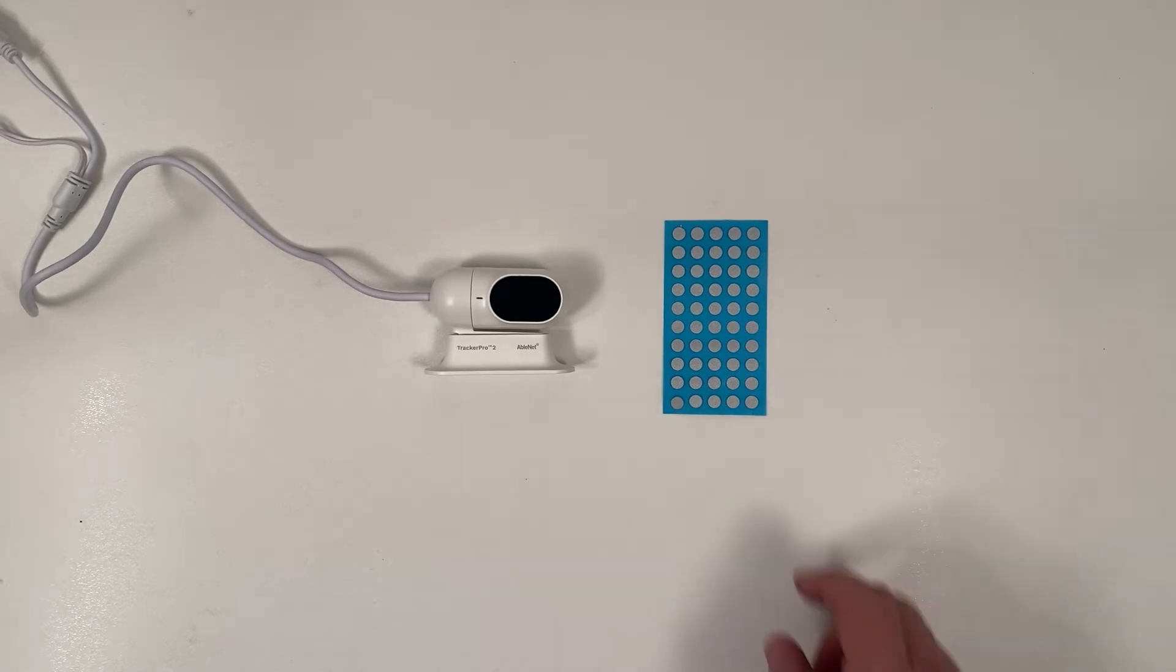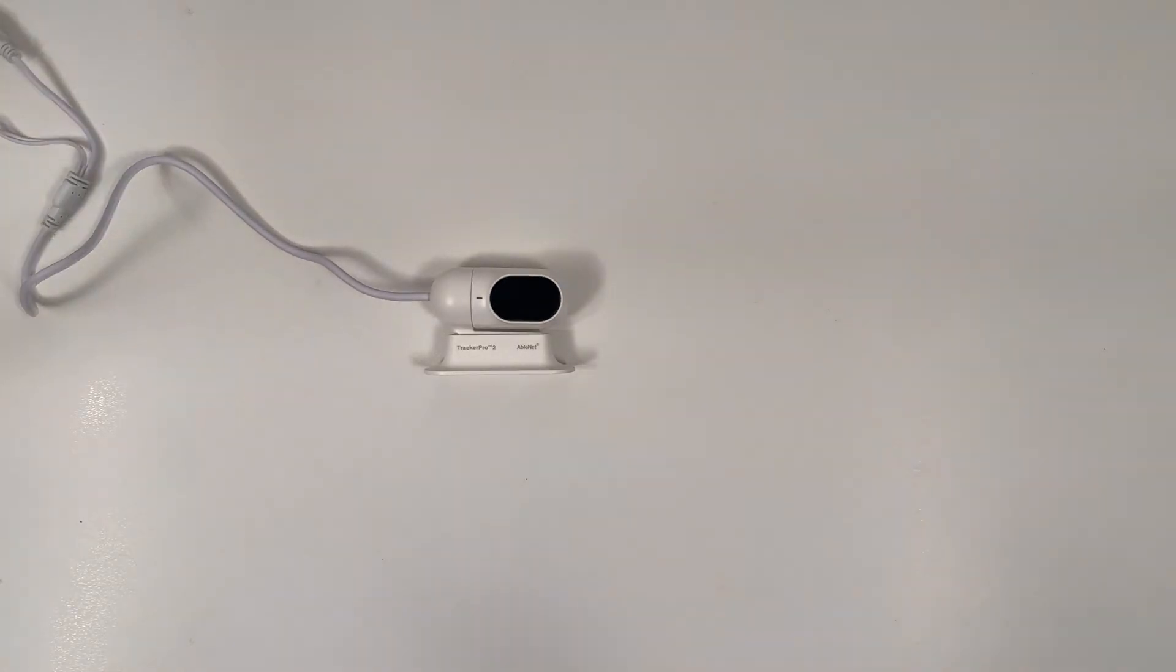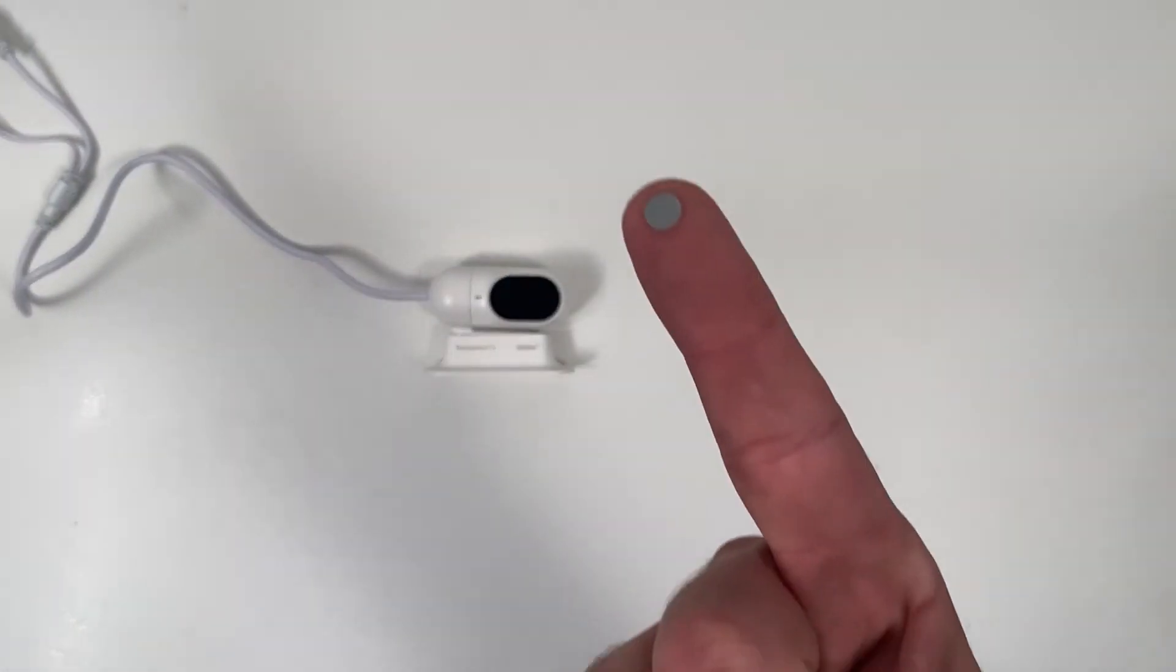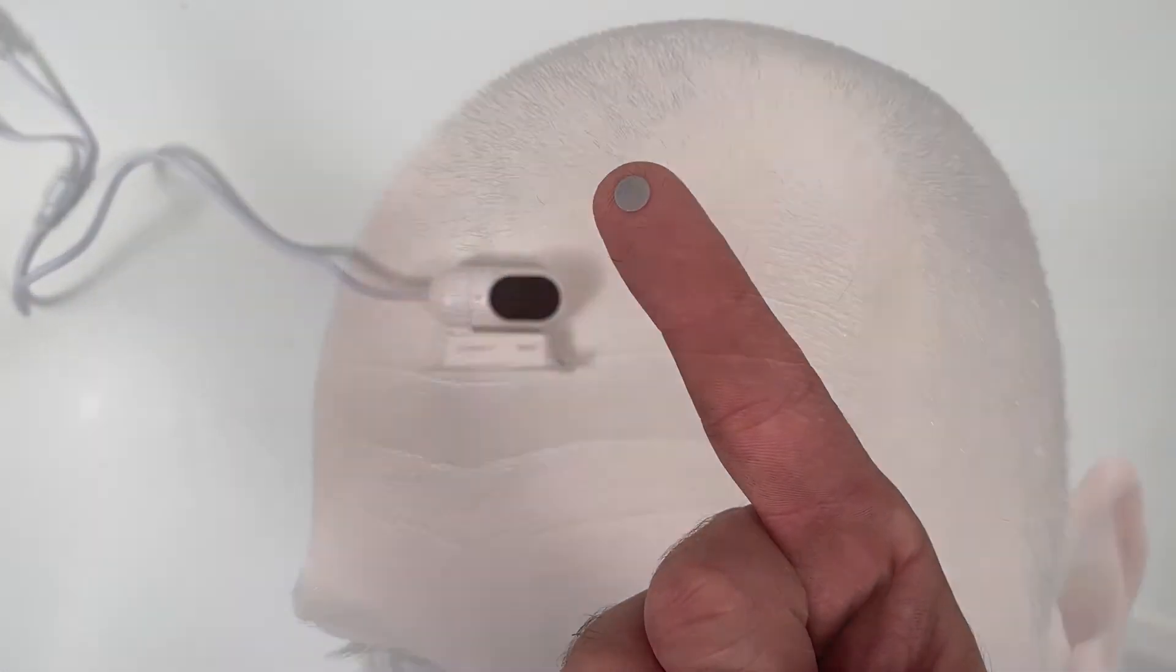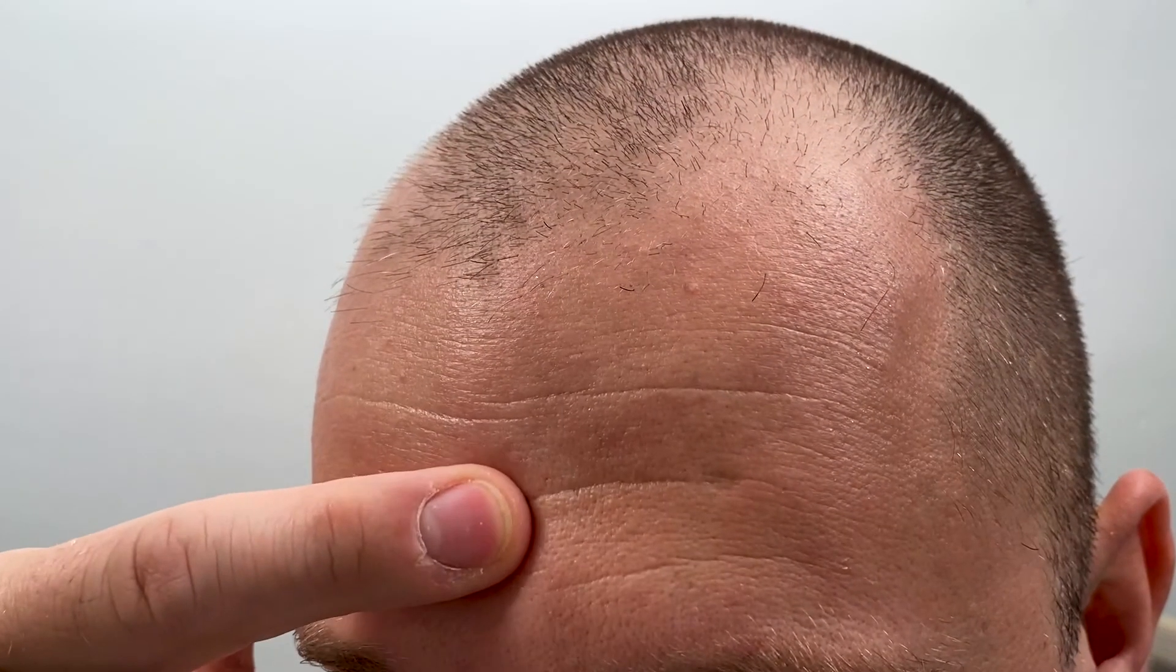To get started, you will need to place a Tracker Pro 2 reflective dot on the forehead of the user.